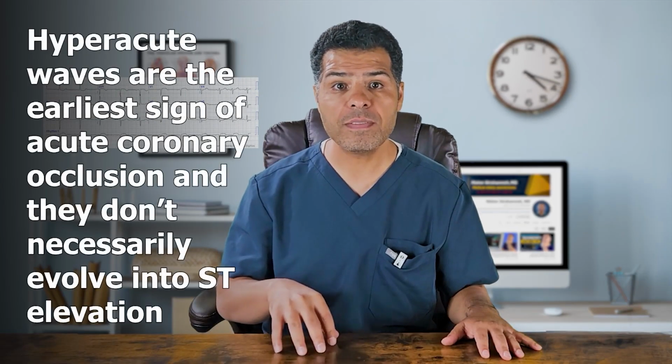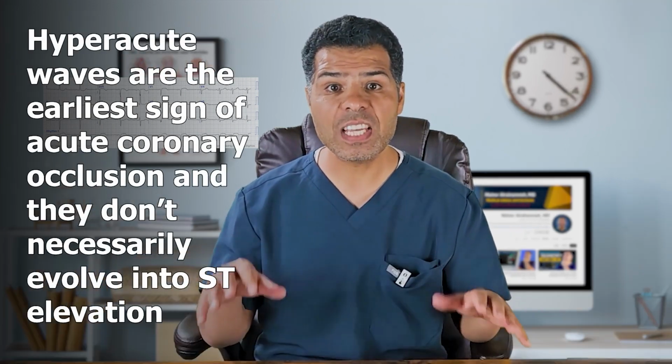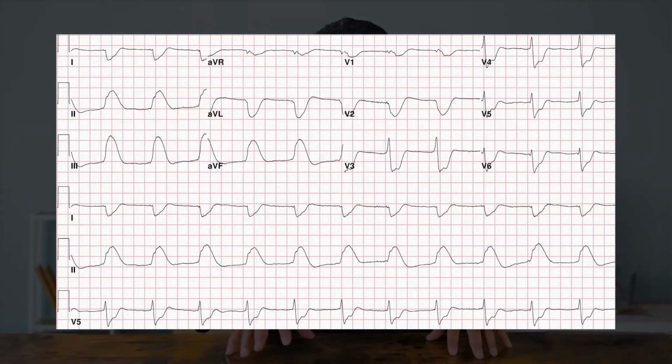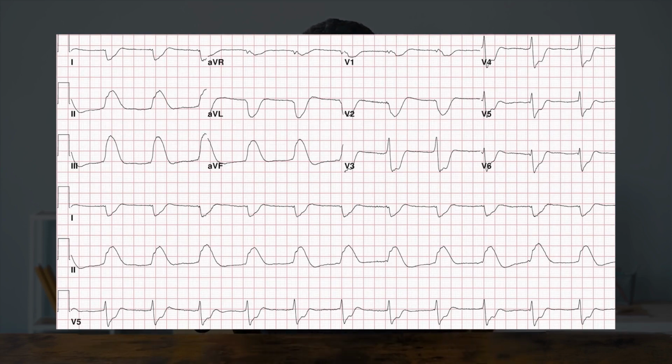We must recognize the hyperacute T-waves pattern. Hyperacute T-waves are the earliest signs of acute coronary occlusion, and they do not necessarily evolve into ST elevation, as we mentioned earlier. How about this EKG obtained from a 75-year-old man after he collapsed to the ground in cardiac arrest while shopping with his wife?